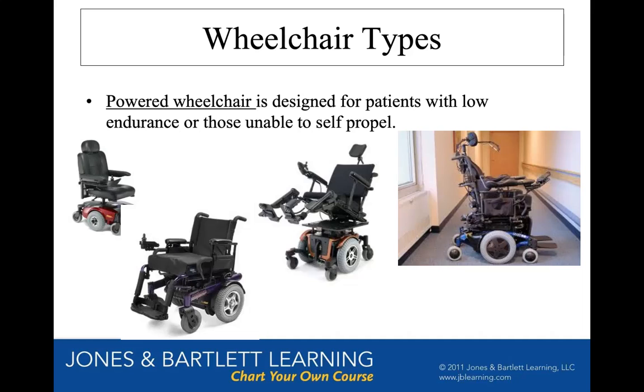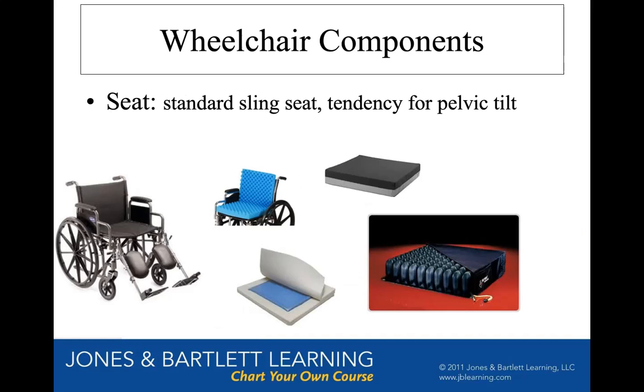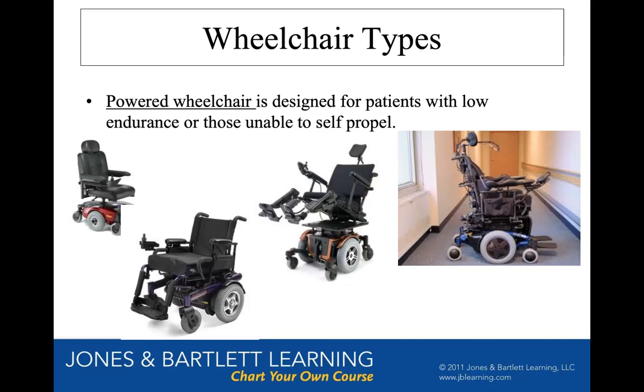but you can see there's something sticking out of the headrest. And I think I will tell you what that is, because I thought the next picture showed it. That's actually a straw that's called a sip and puff chair. This would be a person that has no upper extremity movement left, but they drive their chair with their breath.